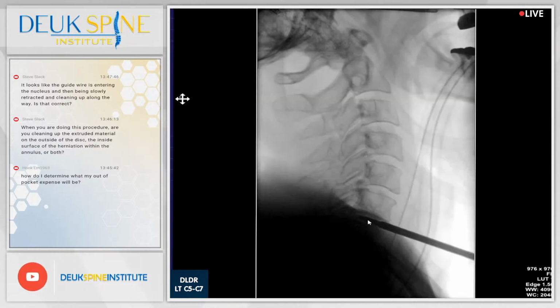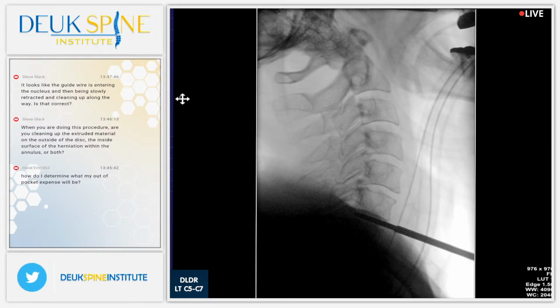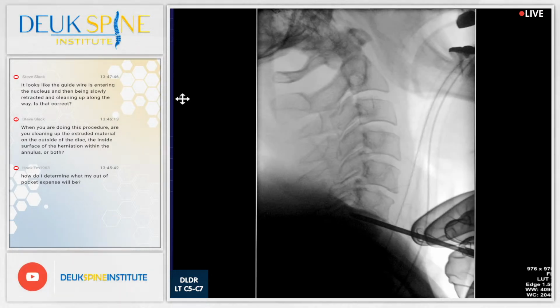This tube is now out. Shot. Okay, you see the tube is out. Show the tip of the tube. There's the tip of the tube. It's coming back all the way. You got to keep the dilator there. Shot. And I keep taking pictures called shots because I don't want anything to move. Shot. I got to keep that dilator in the disc, and I got to bring the tube all the way out. Now this is where you can really make a mistake. All right? You don't want to make a mistake. All right? So I'm being very careful.